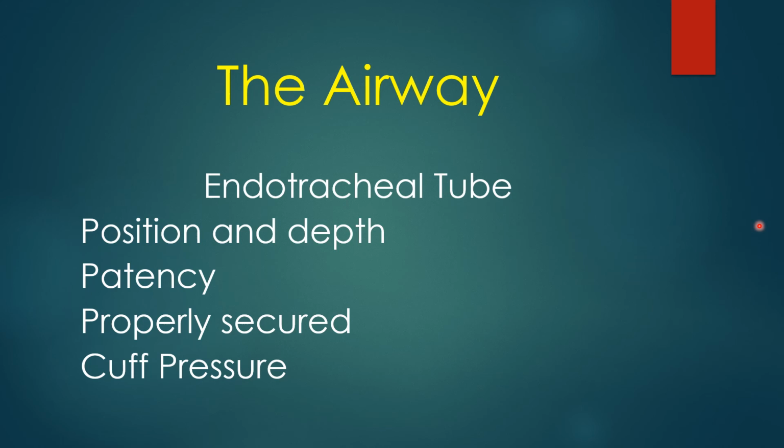If you get past the teeth and it goes down easily, but just a few inches past the teeth, you feel the obstruction. That could be that the tube is kinked in the back of the guy's throat where it makes that turn. Not very often that you'll see that.